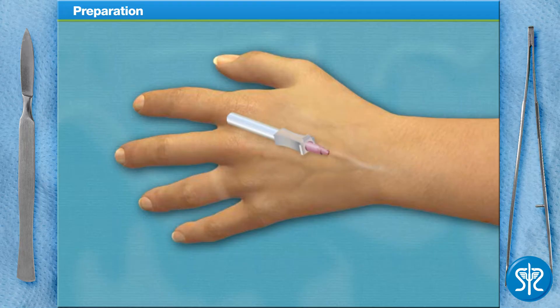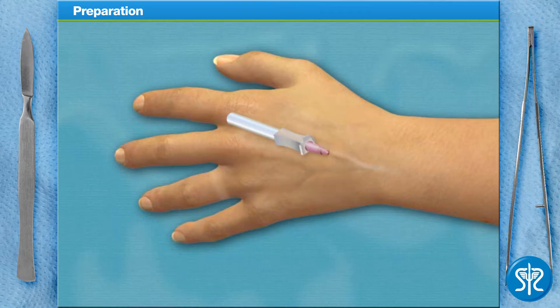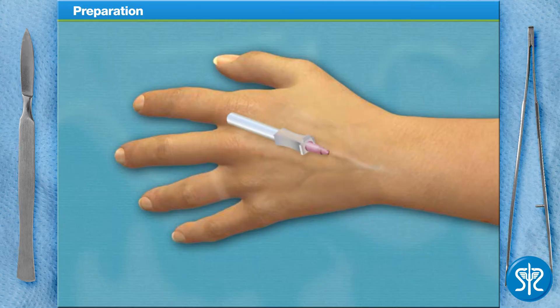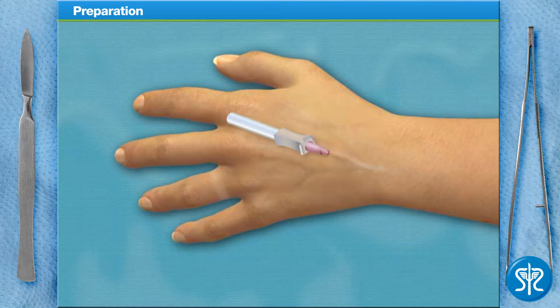The small burst of blood that you just saw in the angiocatheter hub is known as a flashback. This lets us know that the angiocatheter is correctly positioned in the vein. Now I'll release the tourniquet while applying gentle pressure over the vein to collapse it. You can remove the needle — this will reduce the amount of blood that may pour out of the angiocatheter while the needle is removed. Once you remove the needle, I'll properly dispose of it in a sharps container.